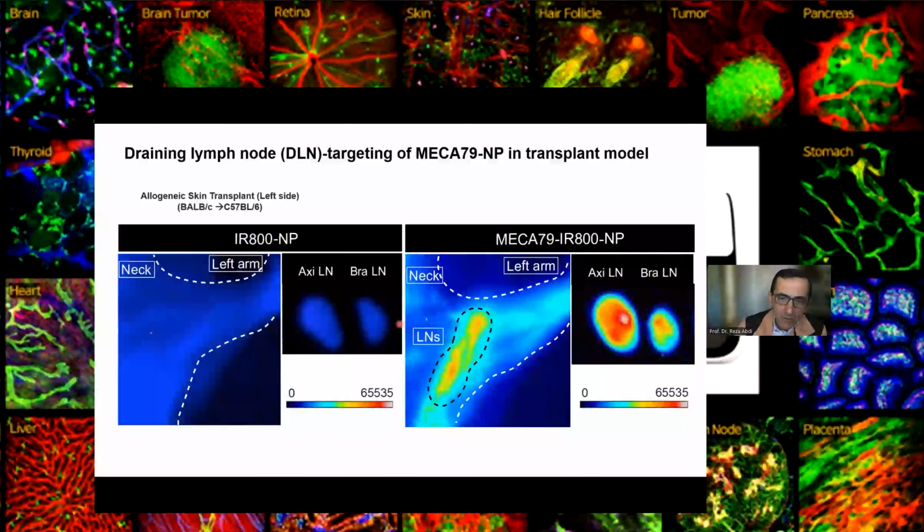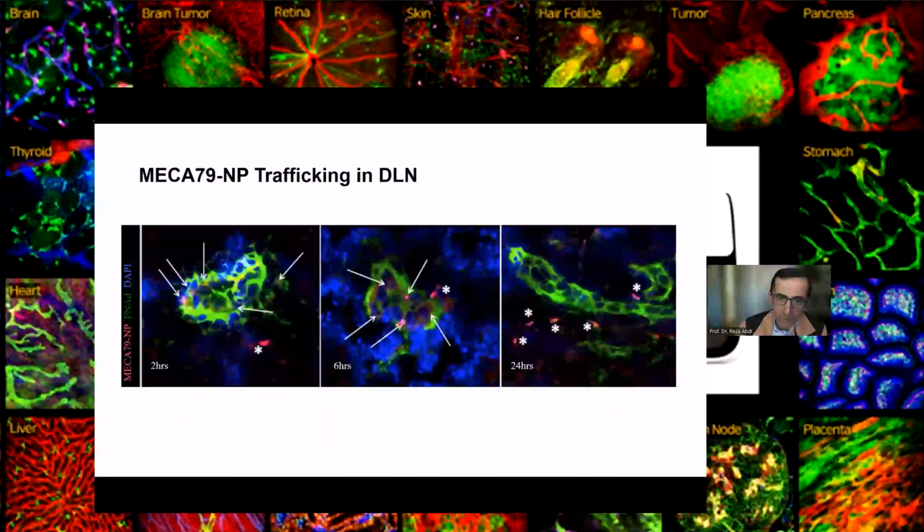This was very interesting. We can do a standard homing of these particles over time. But again, I think what excites me the most is seeing how these particles are taken up by different cells, not just by tumor cells, but by antigen presenting cells.